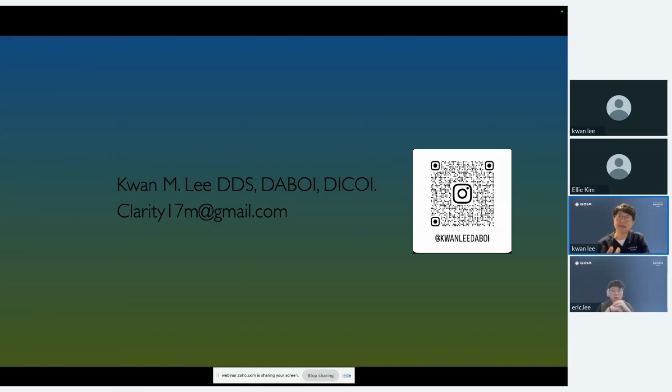Then it'll give you a nice, good volume for you to do push and pull, and you want to feel the pressure feedback. But if you are only adding 1 cc of liquid, then you don't get that pressure feedback right away. The more liquid, the more saline, the more you can feel the real-time pressure feedback. So that's usually 10 cc. That's my recommendation. Okay, anything else here?